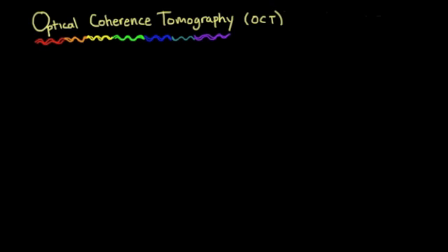But what is OCT? To start, I'm going to look at the name here, so Optical Coherence Tomography. Optical just refers to light. So unlike ultrasound or some imaging that might use sound, OCT uses light. Coherence is a property of light, specifically light of a constant phase difference.